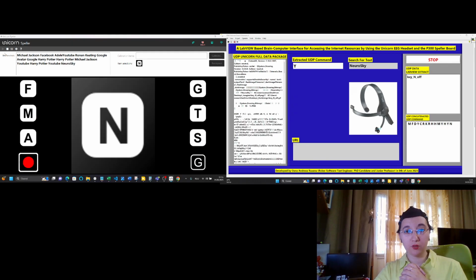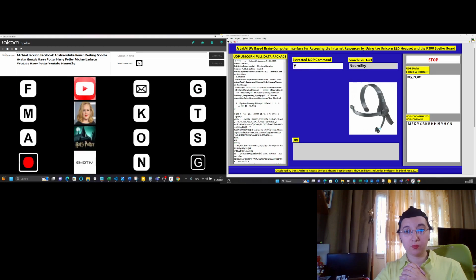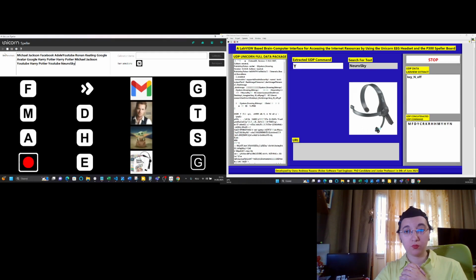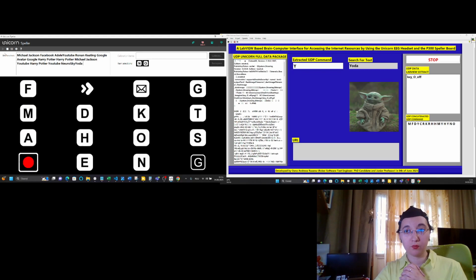No, it's not correct here. Let's focus again. Okay, now it's correct. Yoda was selected, and now on Google.